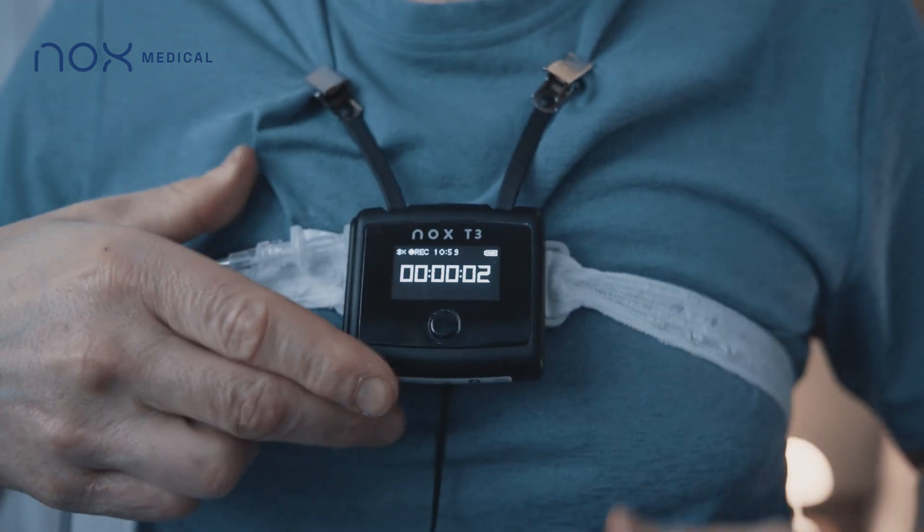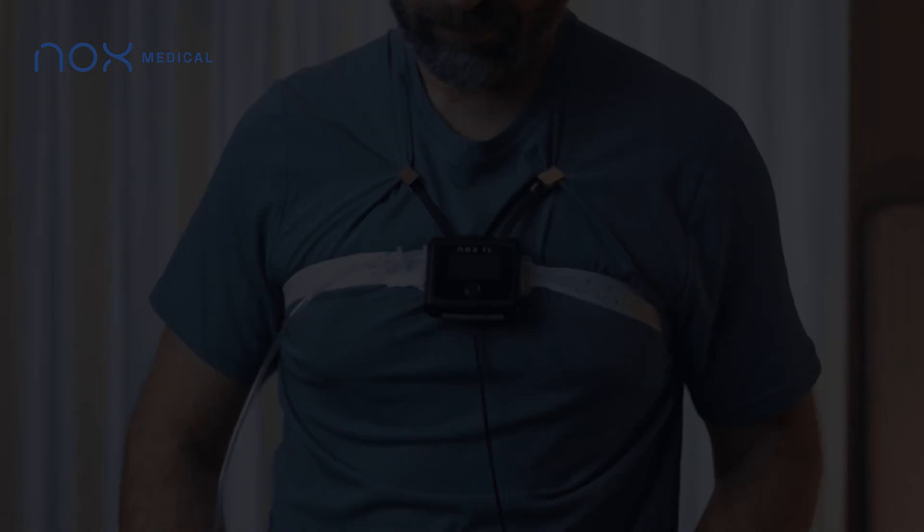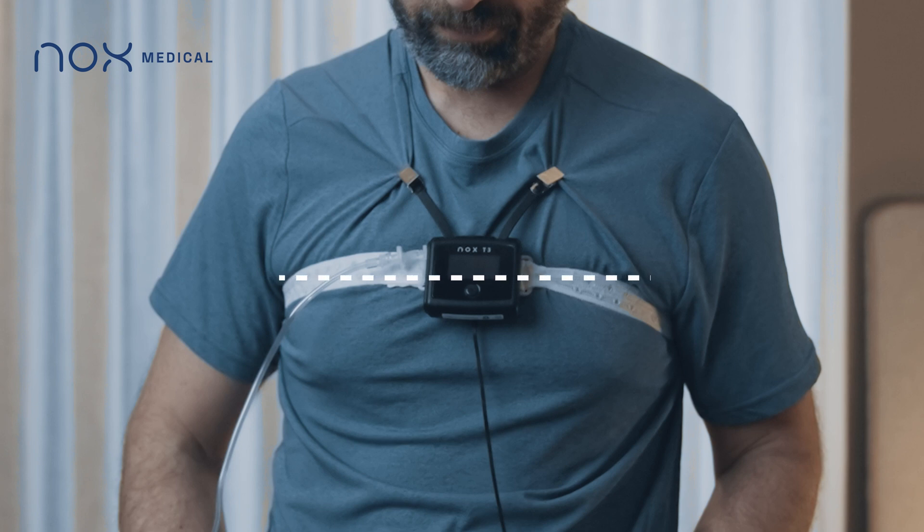Once the counter is visible, the study has successfully started. Position the belt just below your armpits.